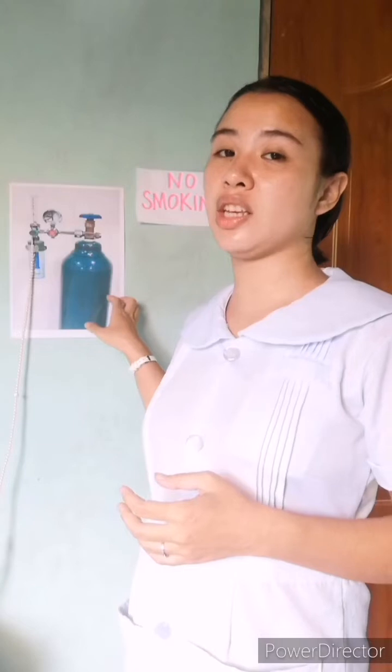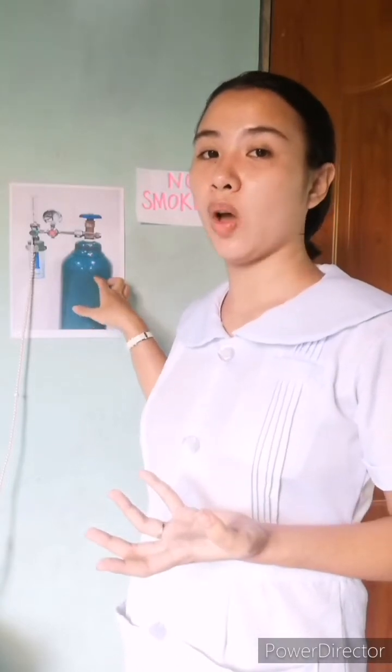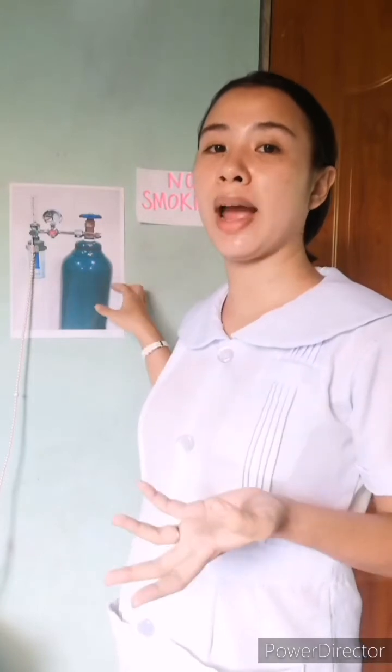After we assemble all the equipment, we need to check the equipment, especially the oxygen tank, if it is functioning well and if there is oxygen, so as to provide immediate care to the patient.